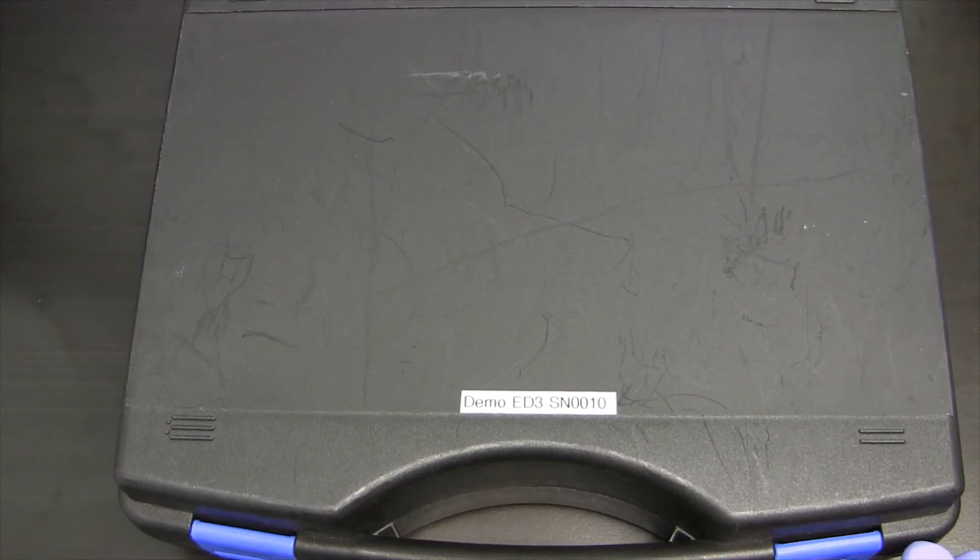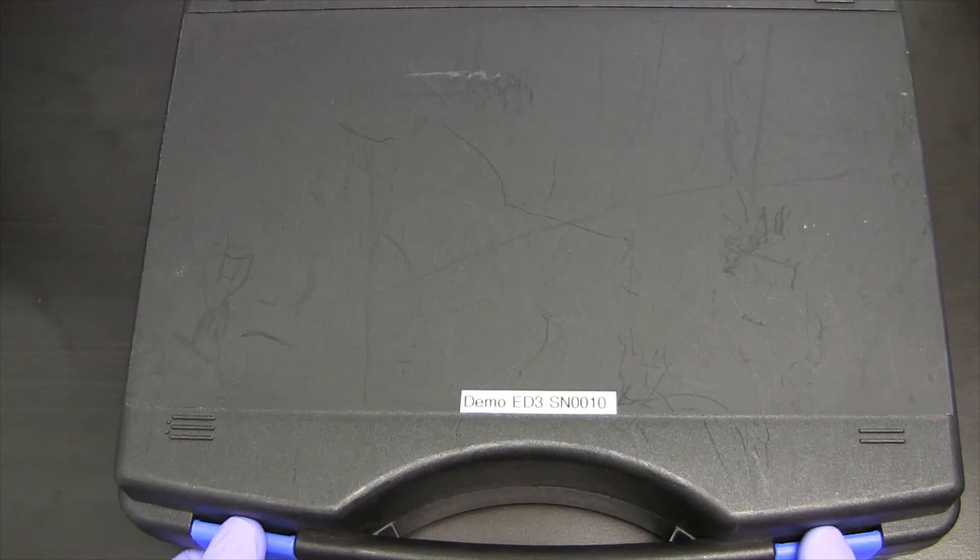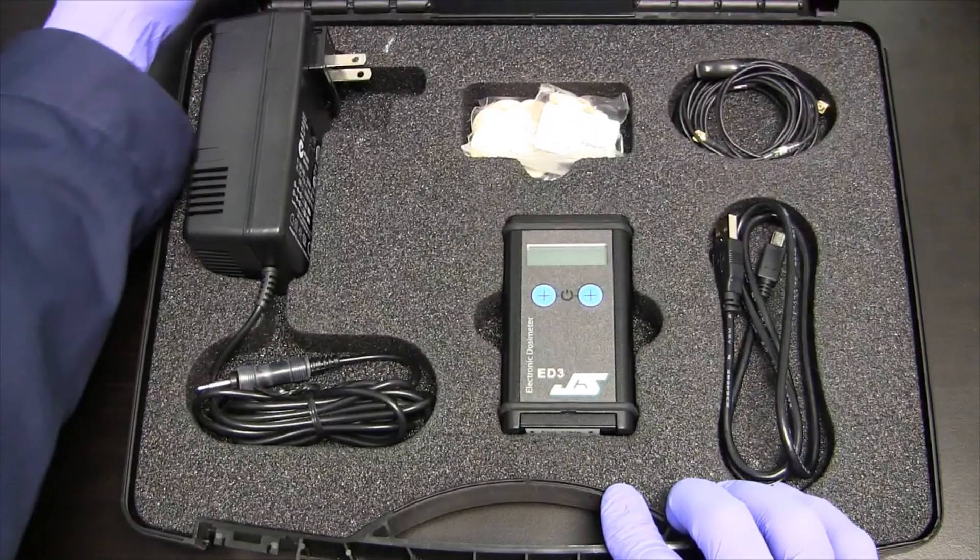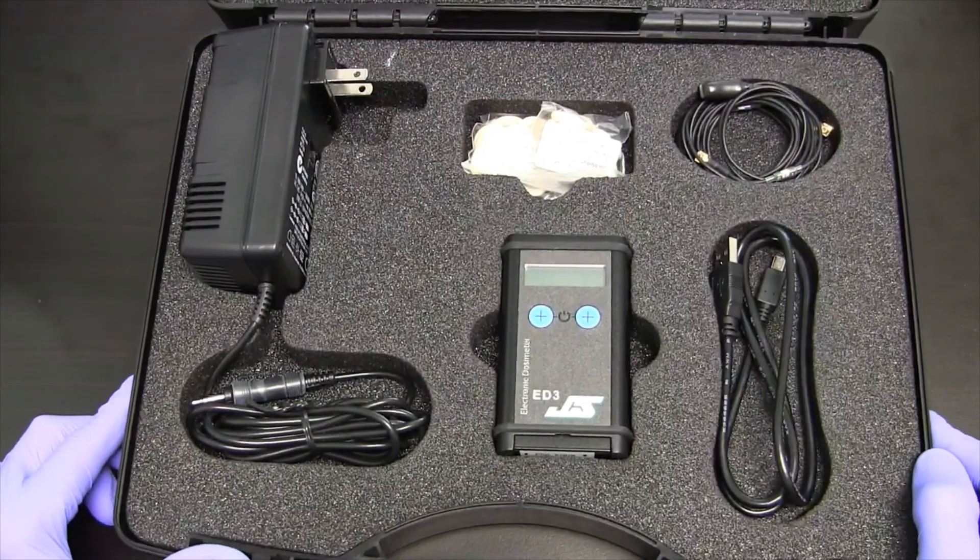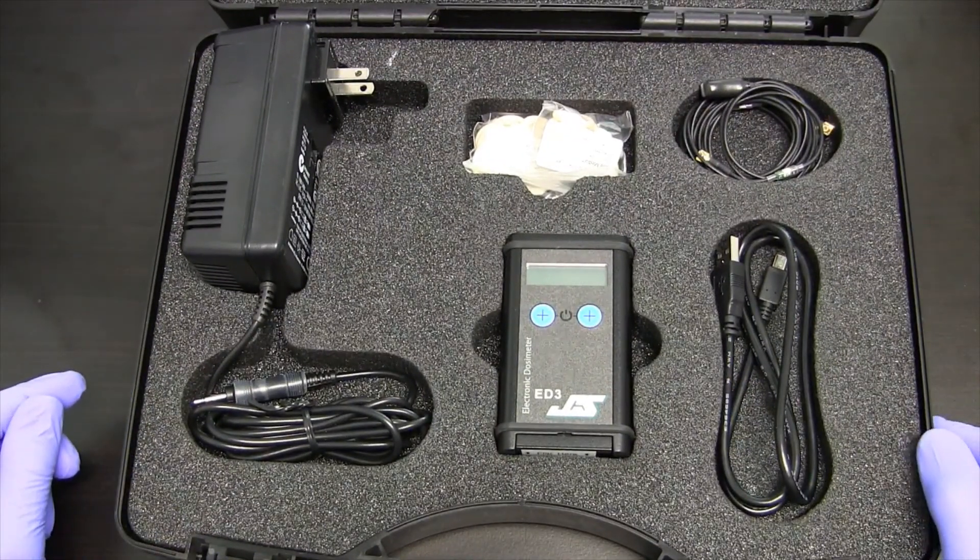This video describes the ED3 active extremity dosimeter. This is the case that the dosimeter comes in, has two locks to open it. And what you'll see here are the different components of the ED3.